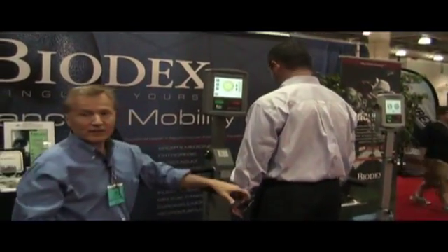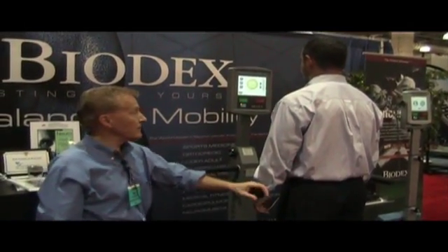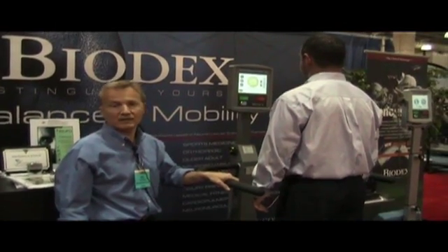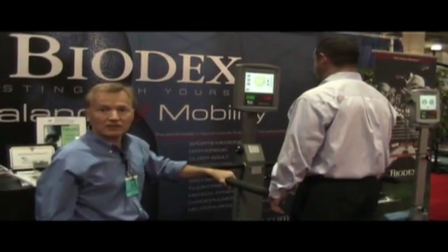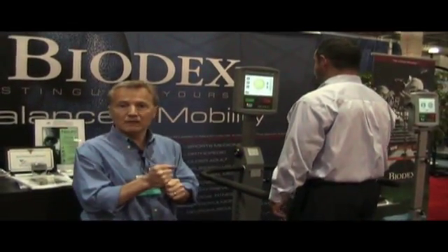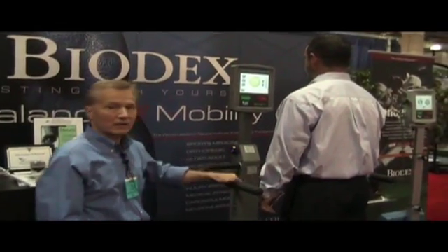With the six different training protocols and five different tests we can do, it's a very versatile machine. It's great for athletic populations right up to senior populations. We can store up to a thousand patients in the display, print reports of the results, and also accumulate data and print progress reports. So we can document the need for balanced testing and training with our age-based data and show progress with printed color reports and outcomes as well.